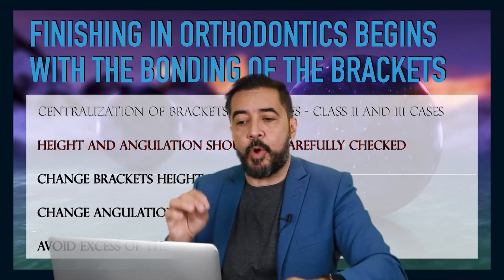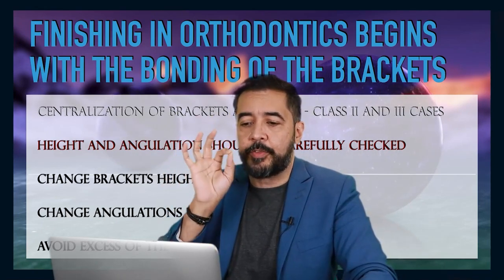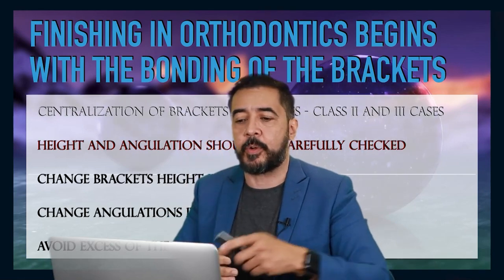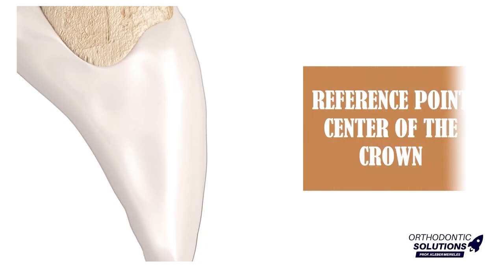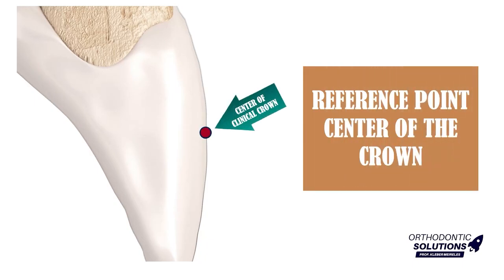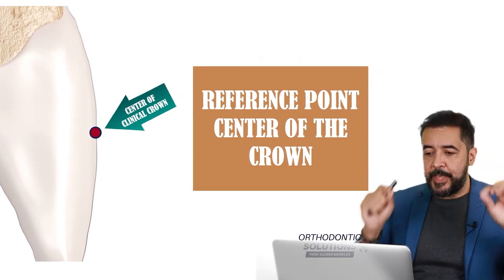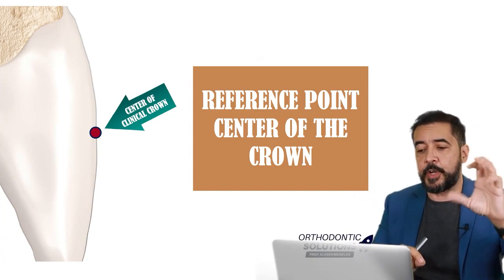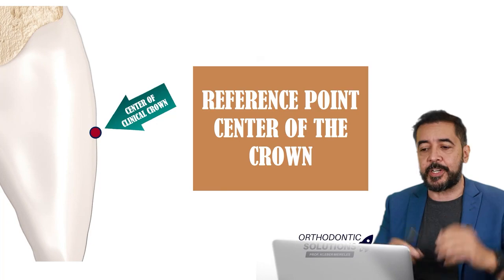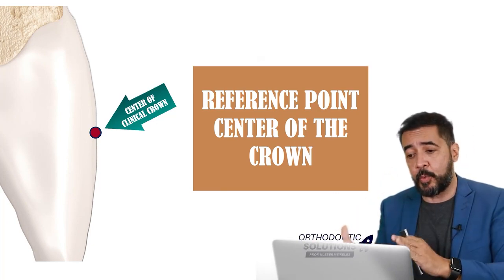So in this part of our course, we're going to deal with the height, the positioning of the bracket and the tube concerning the height, okay? We have to check all the time because we can incorporate some errors in this part of the positioning. What I mean is that when we think about the centralization of the bracket, the vertical position, we have to think about the center of the clinical crown. Why do we think about the center of the clinical crown?